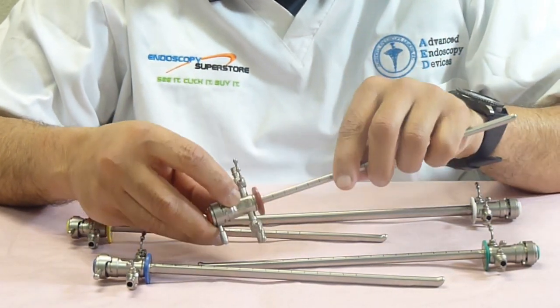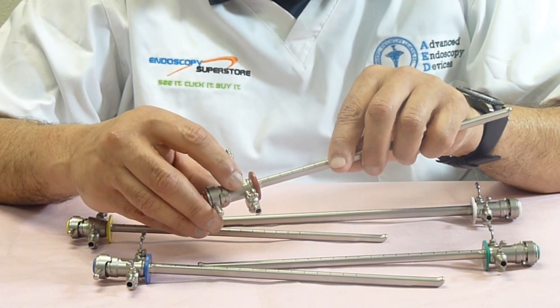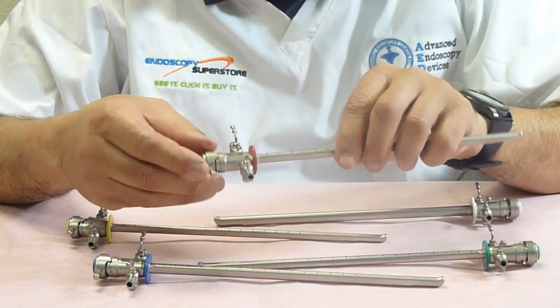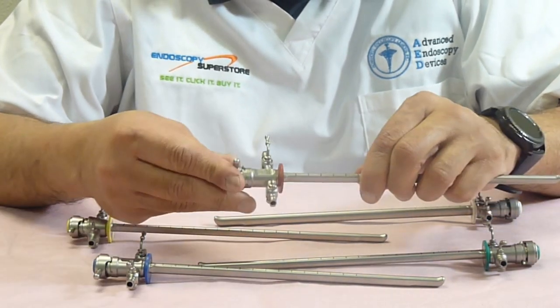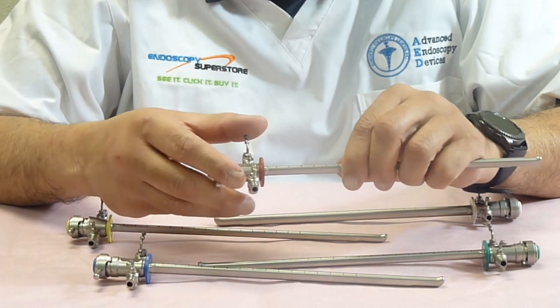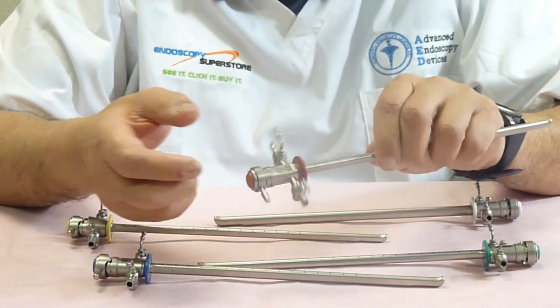The sheaths are marked with the model number, the diameter of the sheath, and the channel sizes. They have a standard bayonet mount that unlocks and locks very easily, as most commonly sheaths do. The valves easily come out to be cleaned and put back in.